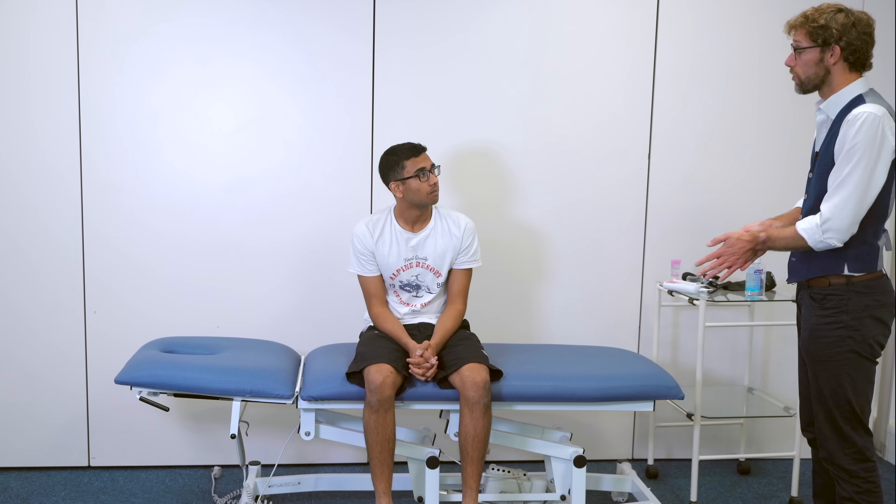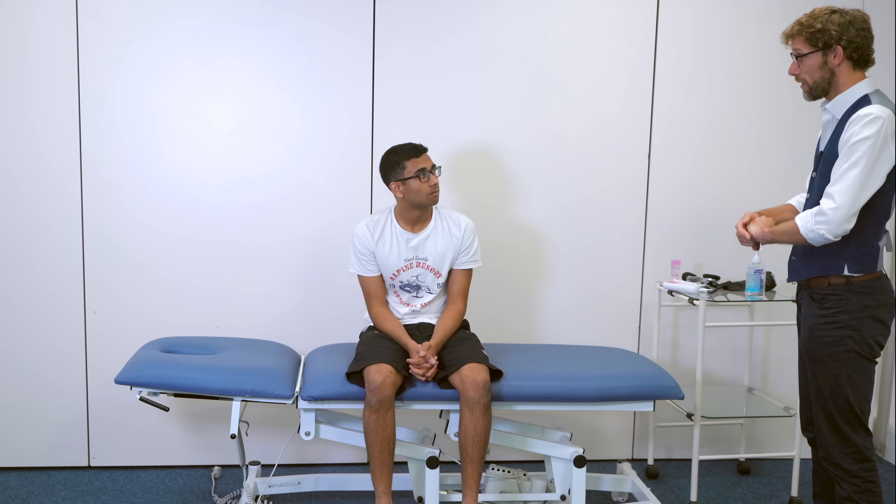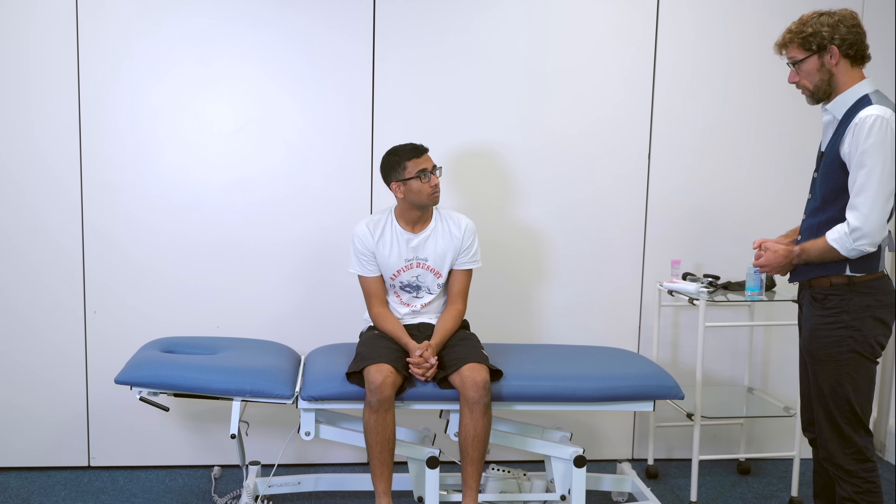So what this is going to involve is taking the blood pressure on both of your arms and then comparing that to the blood pressure in your feet. That is going to involve me having to use a Doppler probe to place on your feet, so there may be a little bit of jelly there afterwards. Is that okay? Perfect.